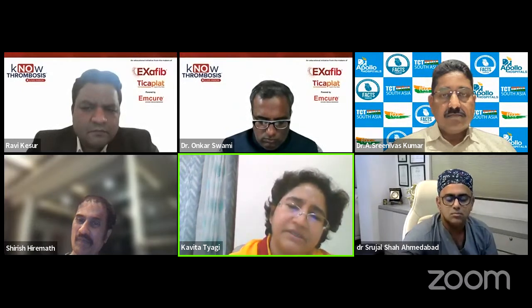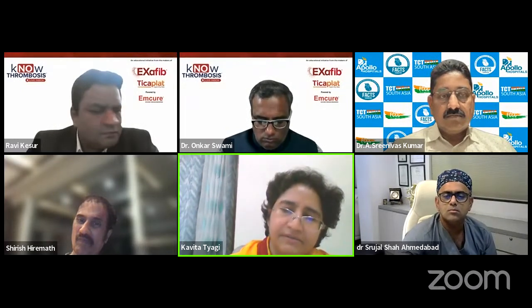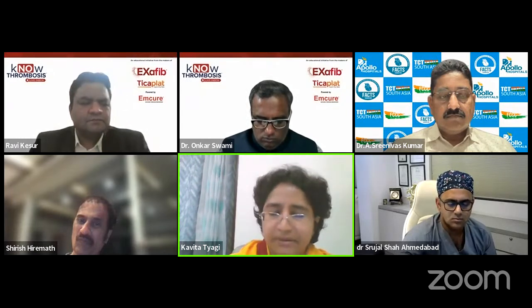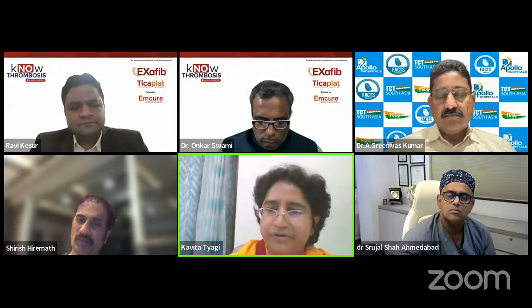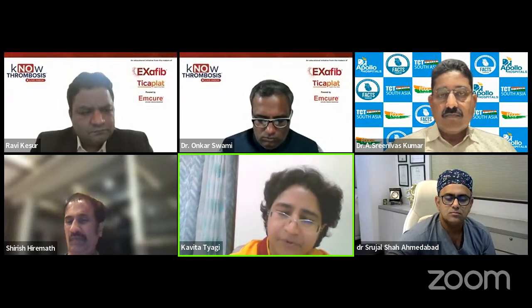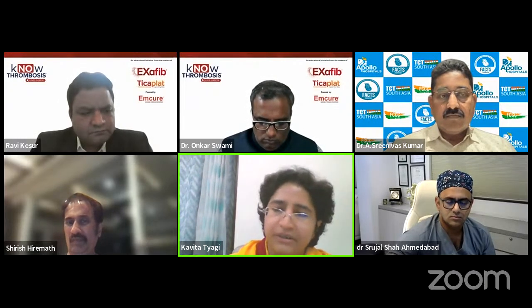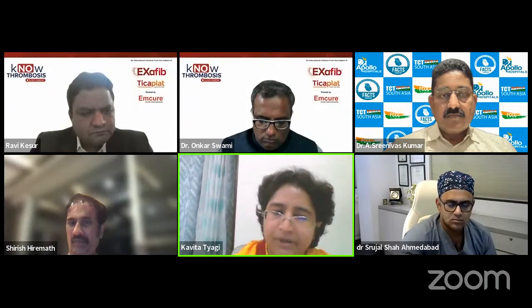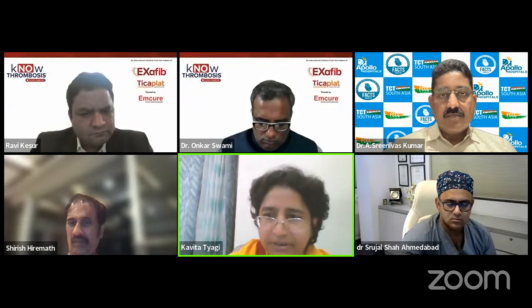So actually, imaging is something which really helps in these difficult decision-making things. OCT showed, and the concept is that the polygon of confluence should be tackled with the stent. People are of the opinion that if you're putting a stent in the LAD ostium, then you need to cover it up to the left main, at least the polygon of confluence. But yes, if imaging shows clear-cut that it is a healthy area, then maybe we can very well pinpoint, especially with these giant stents, since their marker and strut are at the same point.